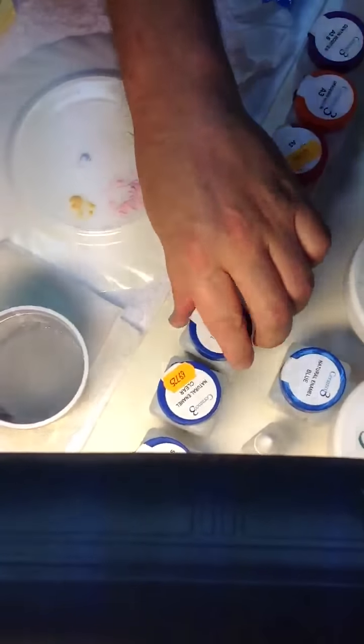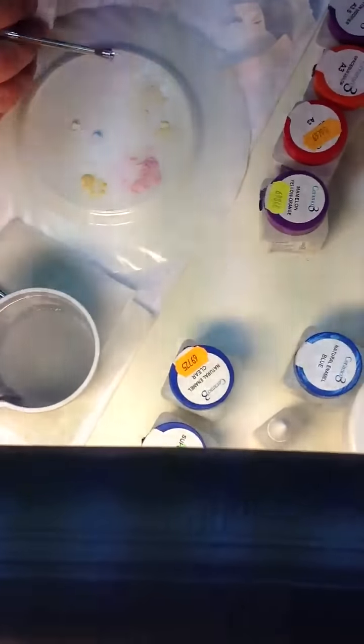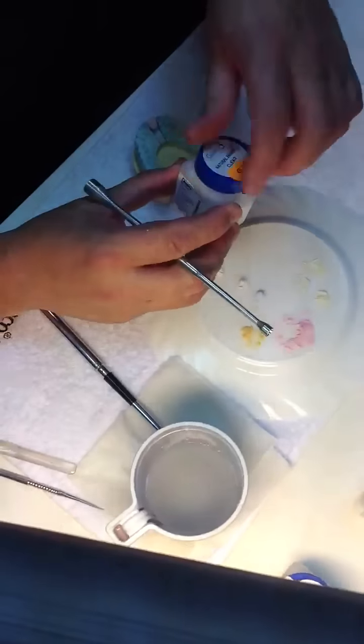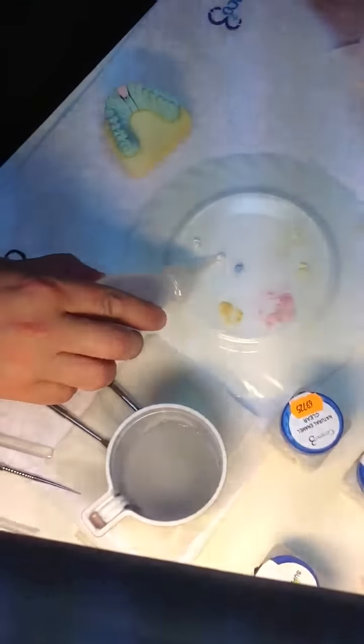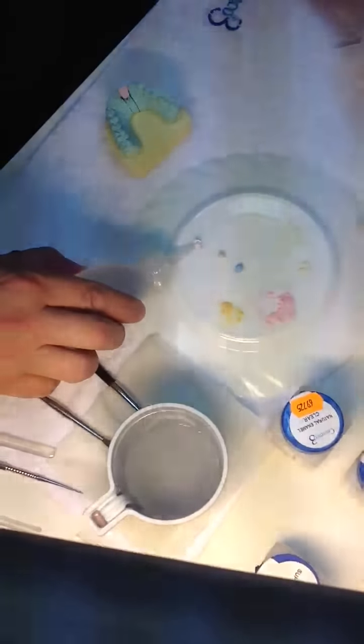So I'll put a little blue. Then some opal. And we've got the natural clear. The first was natural blue, the second light opal, and the third natural clear.